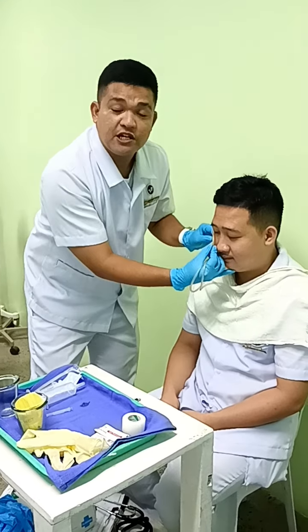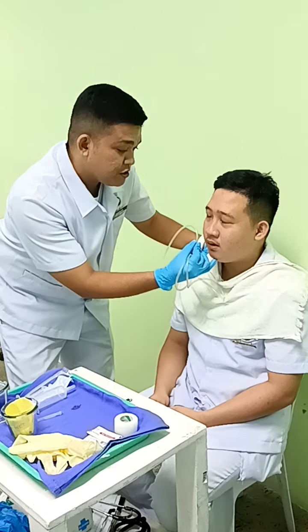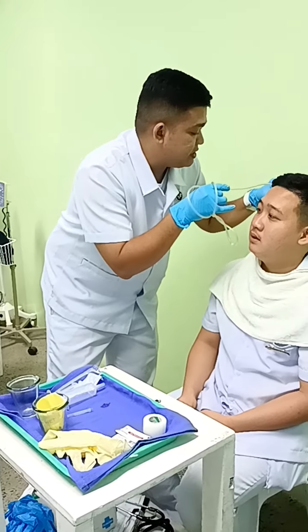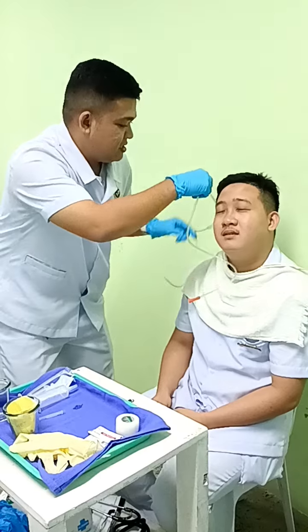Okay, and instruct the patient to swallow. Sir, swallow normally, and as you swallow normally, you can gently advance your tube until such time that you will be reaching the xiphoid or the tummy.